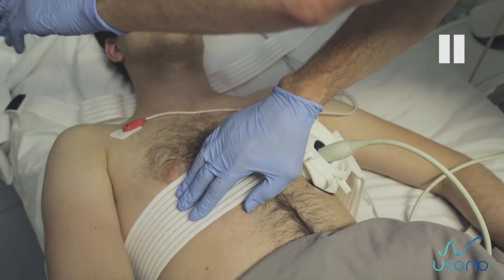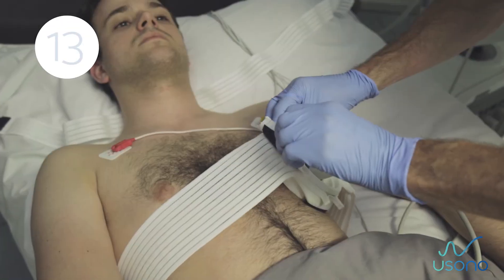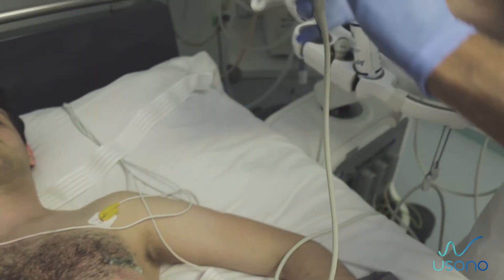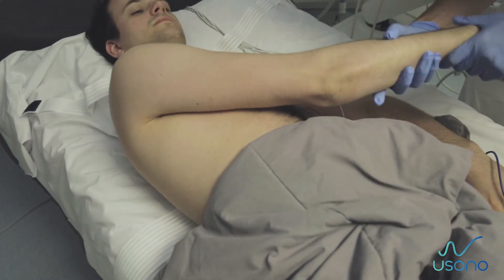Removing the probe fix after examination. Step 12: Detach the shoulder strap from the base strap and remove it from the probe fix. Step 13: Pull and detach both ends of the base strap, pull out the ends, remove the probe fix from the body, and slide the strap out from under the patient.